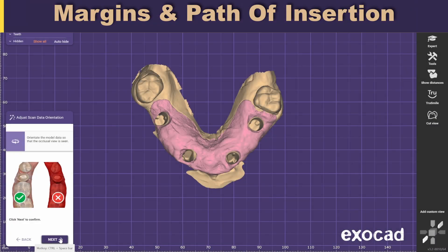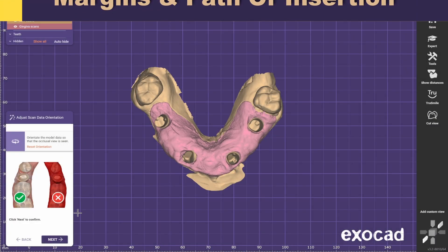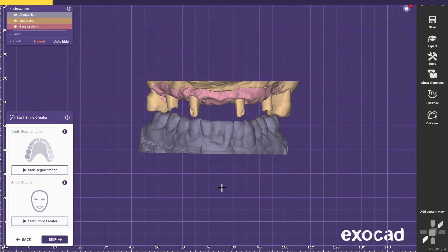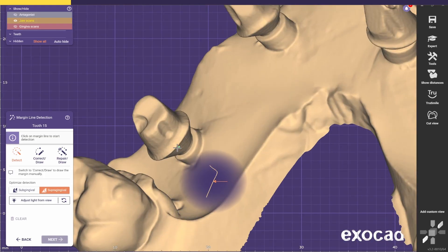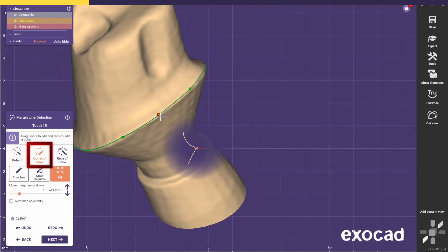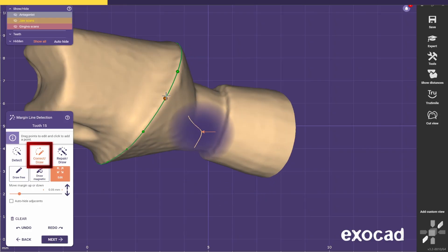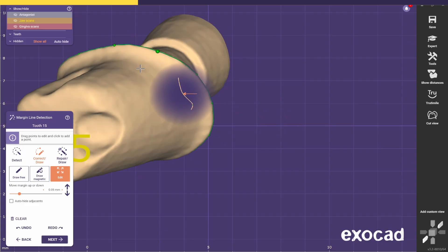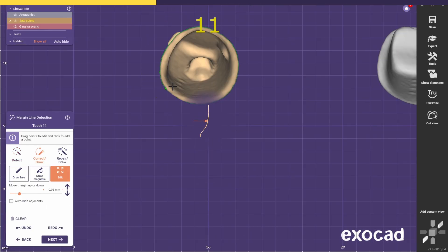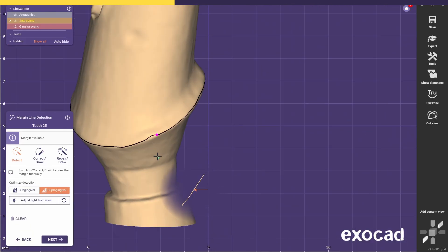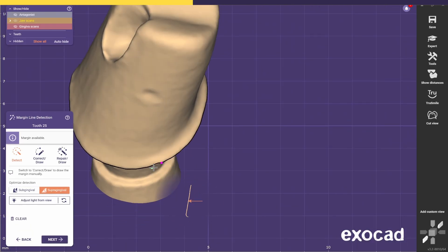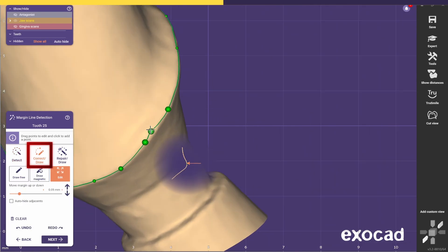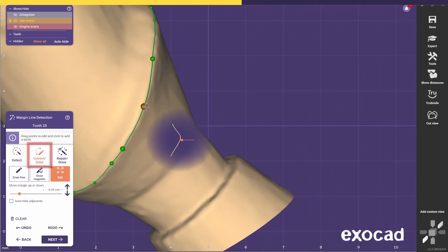Now bring up the scans, make sure the orientation is in the correct viewpoint and go next. For this case we don't have any pictures or pre-ops to follow, so I'll just skip this step. Now select the margins. I always like to double-check with the correct draw tool because if you just select a margin, sometimes the points are not in the optimal position. I do the same for every single abutment. You can clearly see here where the detection went a bit off course — that's why I always like to double-check and go again with the correct tool.